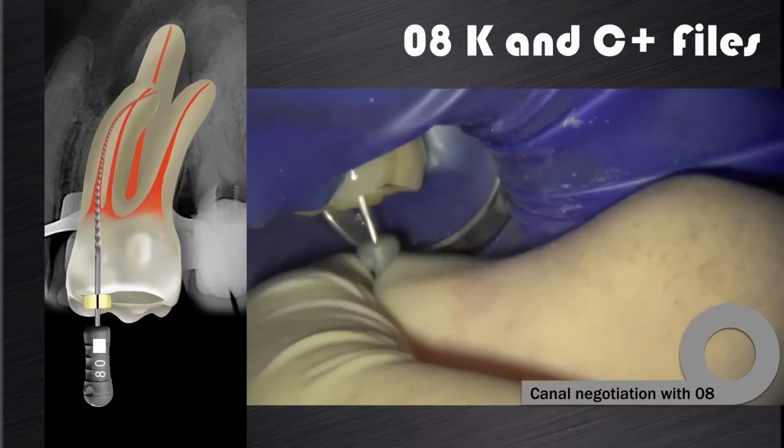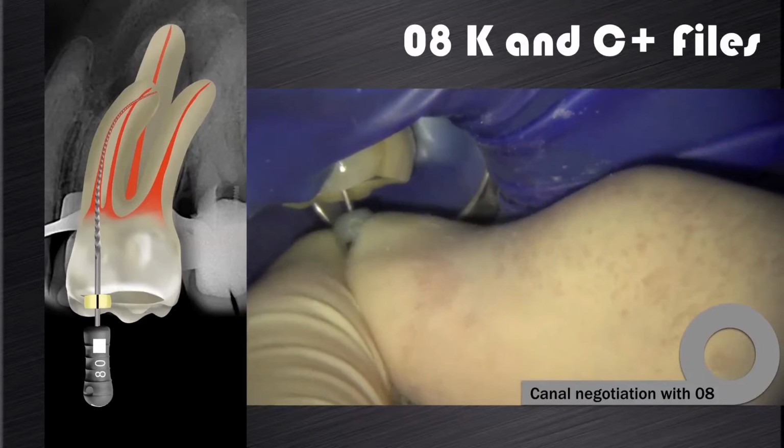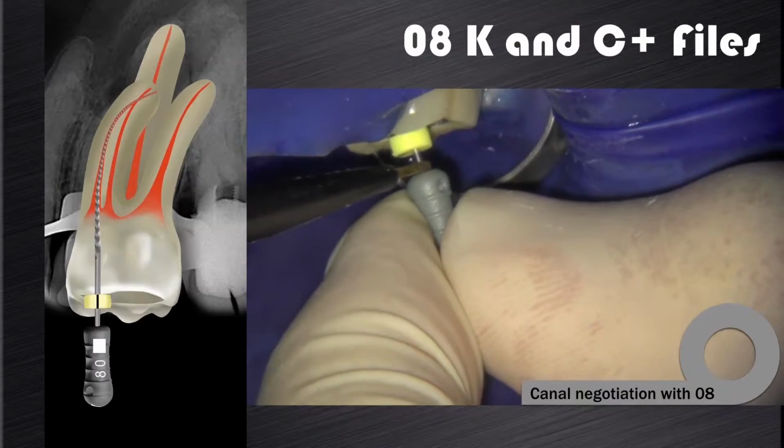In this video clip you can see that I've just achieved patency now. After that I will do my working length using an electronic apex locator.